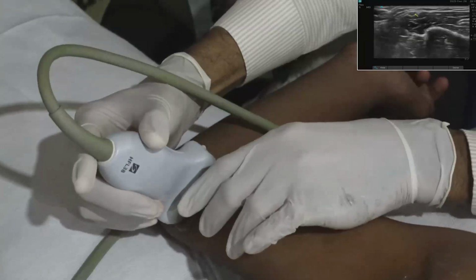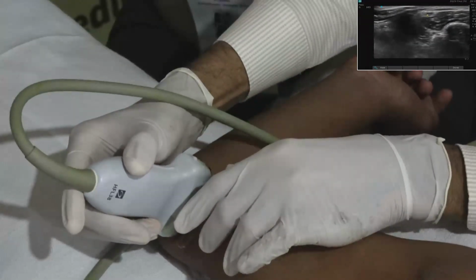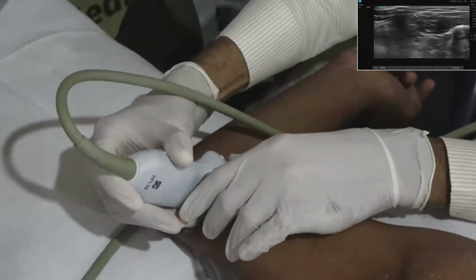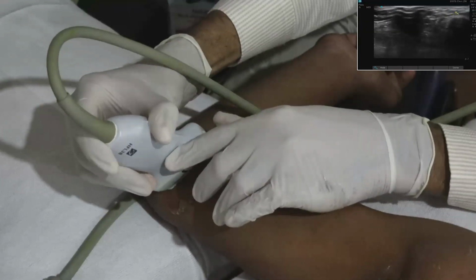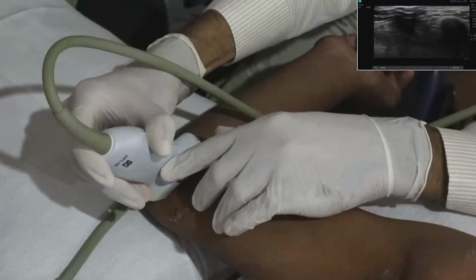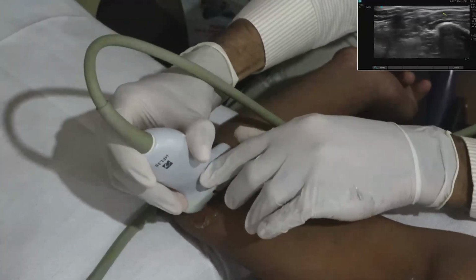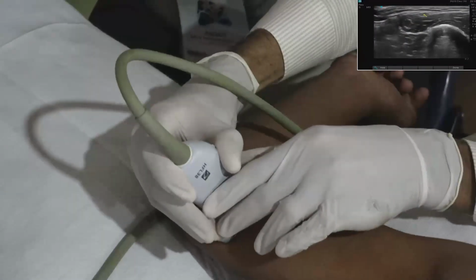Just below the skin we are seeing one structure, that is the ulnar nerve. If you trace it very closely, it is moving along the medial epicondyle. Now I am tracing back to the proximal area.